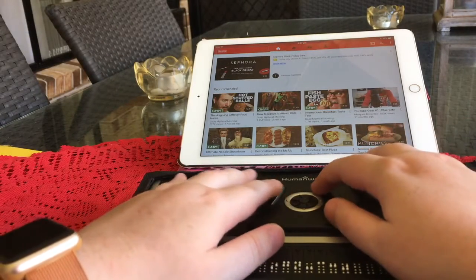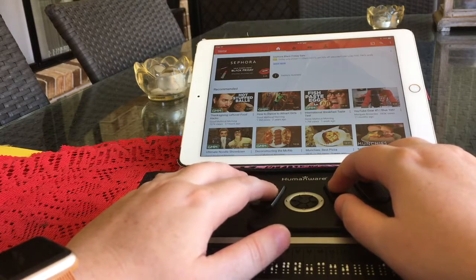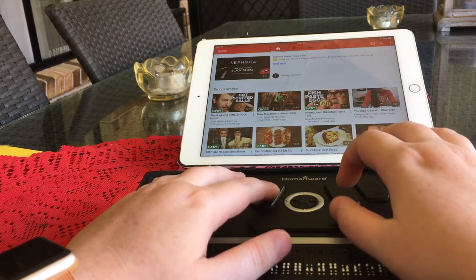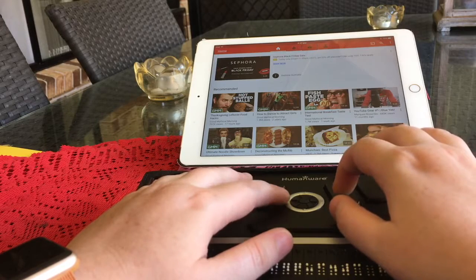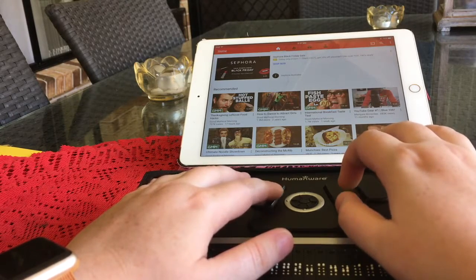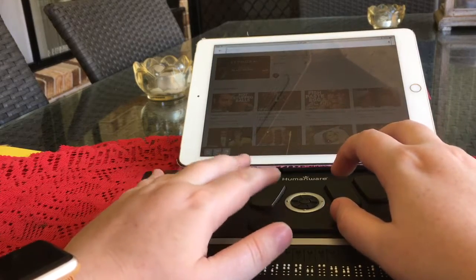And the opposite would be true to go to the end, which would be Space with four, five, six. So we are at the top of the page. Let's search. I press Space with lower C to access the search field.